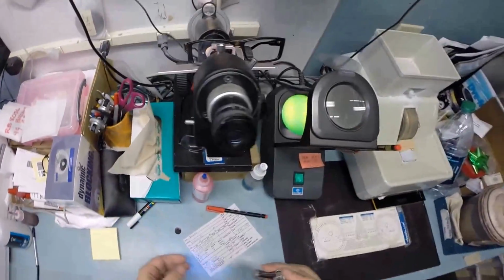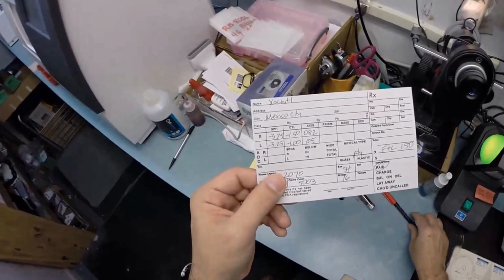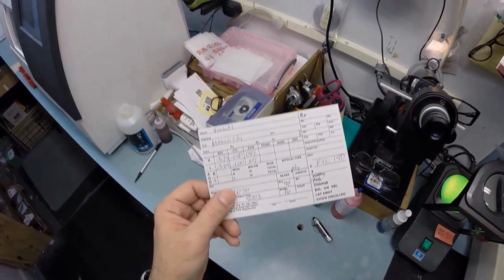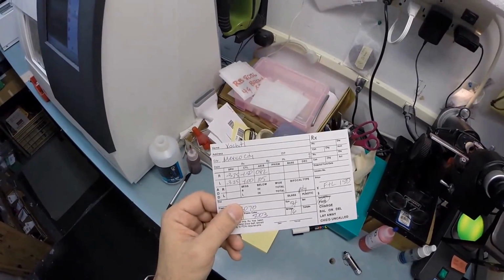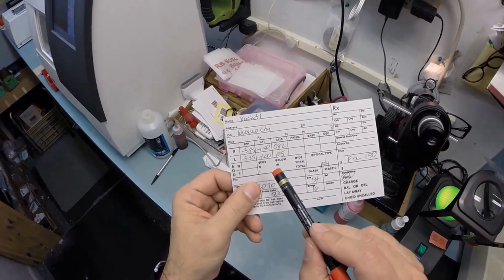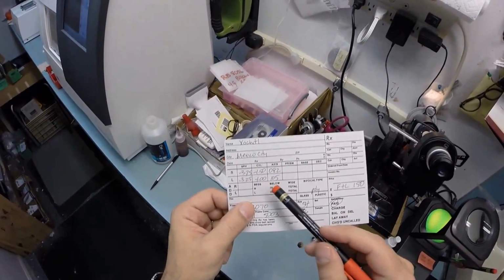Now the unit of measurement we use in the optical world is called a diopter, spelled D-I-O-P-T-E-R. It starts at 0, which we in the business call Plano, which is not just another city in Texas, but everyone else in the world calls it non-prescription. It starts at 0 and goes up in quarter increments, 0.25, 0.50, 0.75, 1, so on.